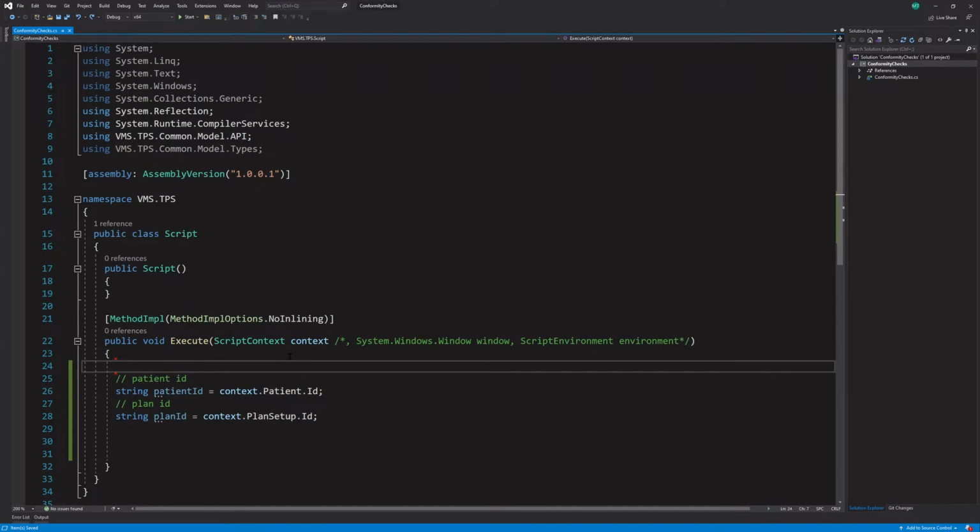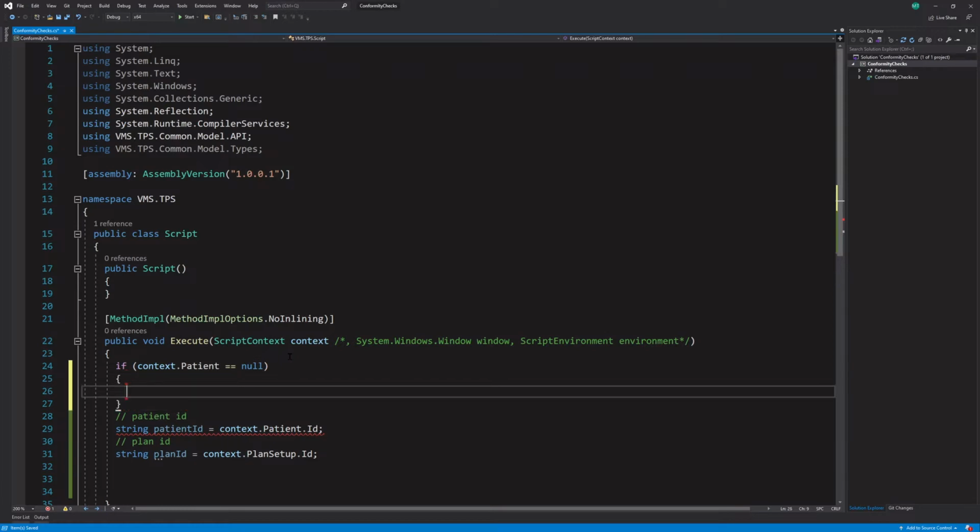Let's check to make sure there's a patient first. So if context.patient... well, I guess I've already kind of ruined it. If it's null, I was going to say I could just not do this and run it without a patient so you could see what it would do, but basically it would crash. So I kind of already ruined that one. But let's just provide a message to the user.